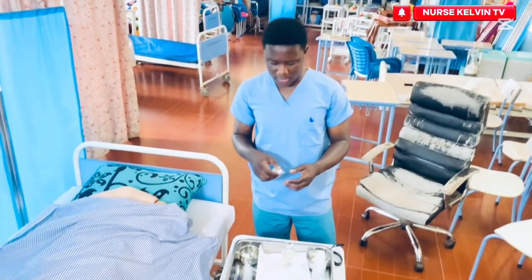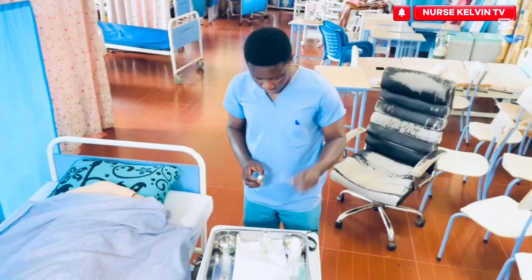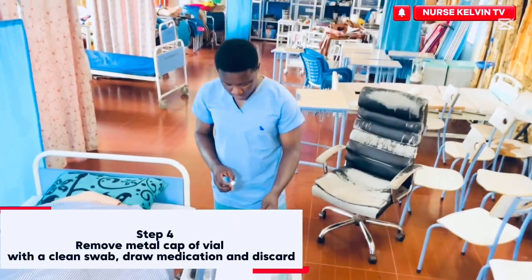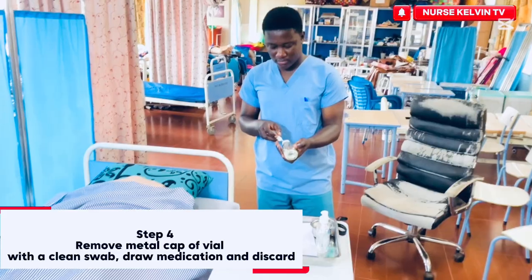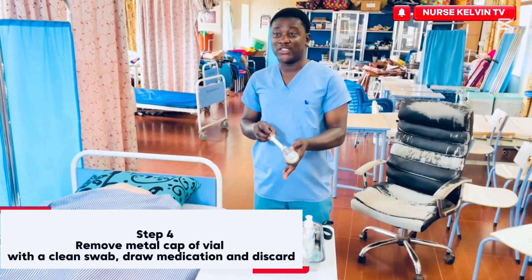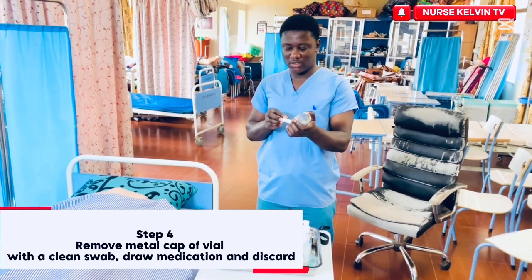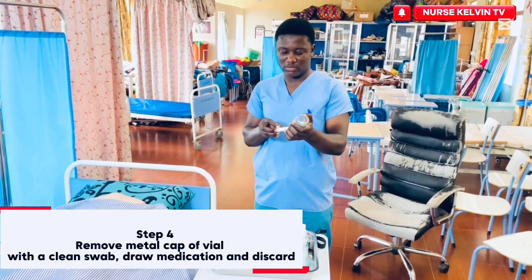So take it like this. You put it here and take your medication. Then you draw and check the dosage, the amount that you are supposed to give to the patient. So you do it.